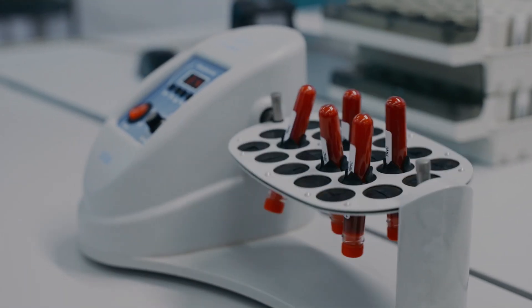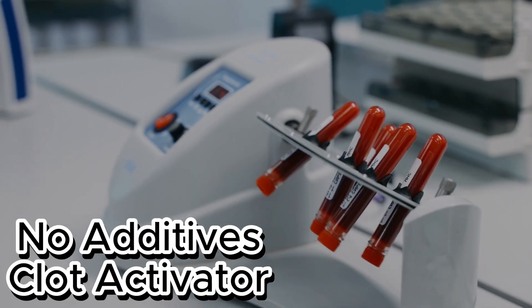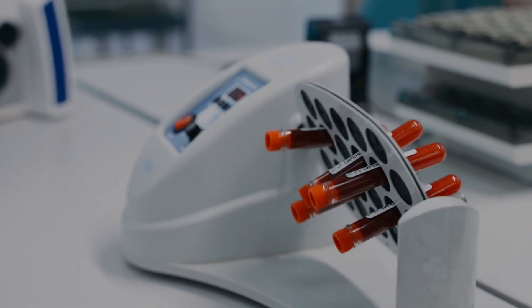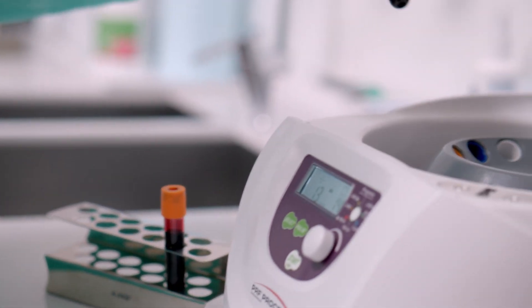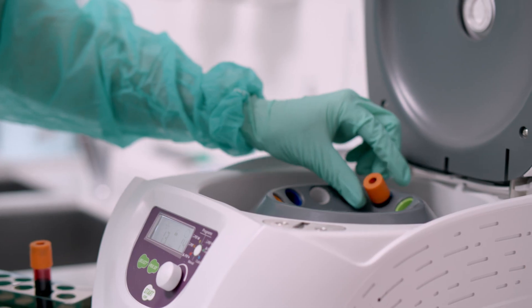Next is the red tube. Super simple — this one usually has no additive, or sometimes a clot activator. It's mainly used for getting plain serum. Think chemistry, serology, or immunology tests. If you've ever had a routine blood test, chances are some of your blood went into a red tube.